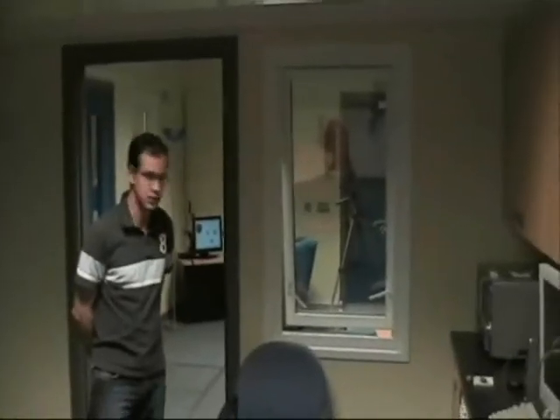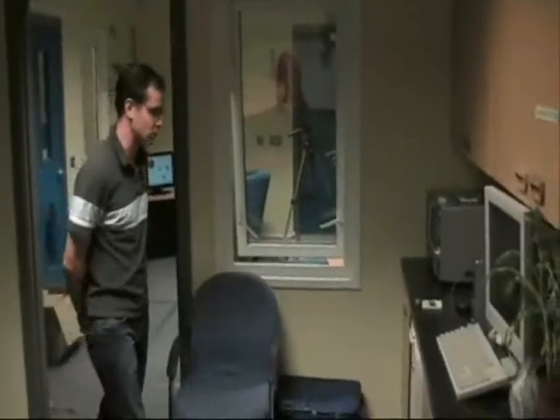So if I now come into the room, the first thing the system does is via this PIR sensor is detect that I've actually came into the room. So that has now activated, and that is the first sort of step in the sequence to the system acknowledging that a person is going to have their lunch. The next couple of steps involve going into the fridge. So we have another sensor here which detects that the fridge has been opened. I can go in here and lift a sandwich out or something that's been prepared earlier.